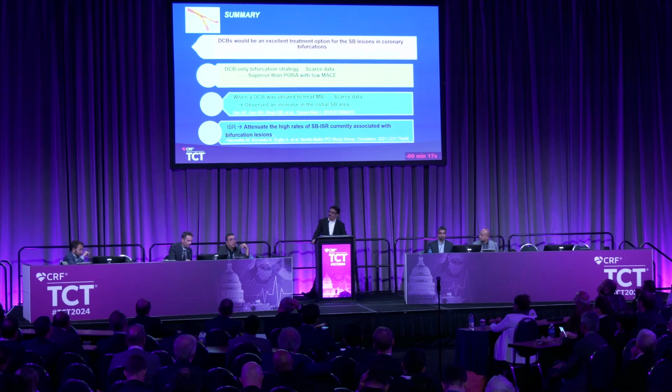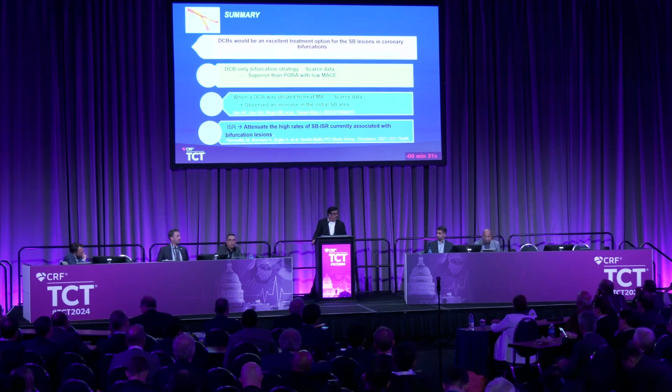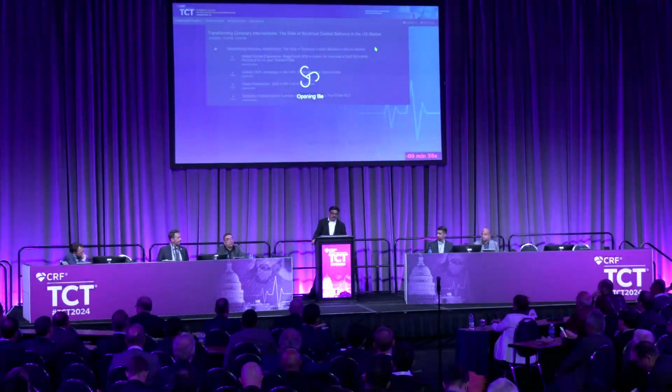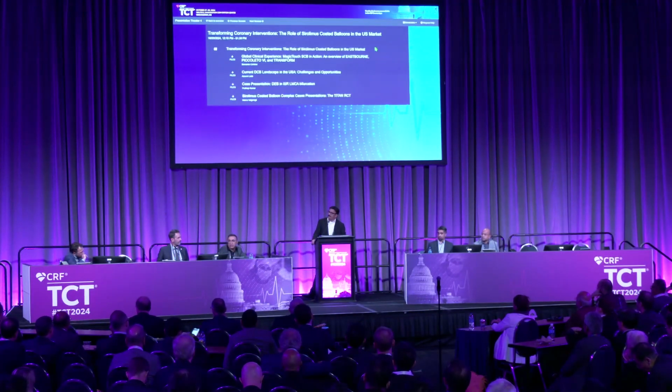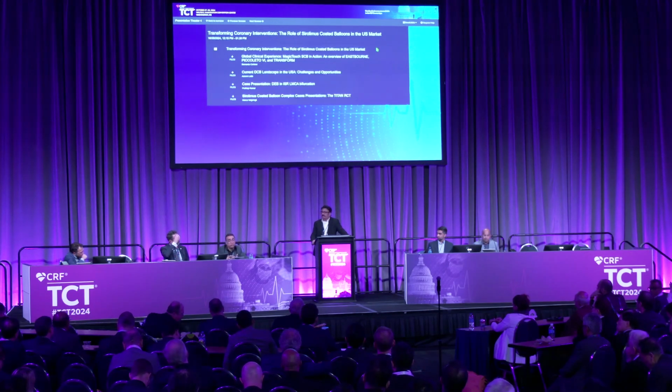Yeah. So maybe I'll just use Ajay's words because he should say this. When we look at the AGENT study, I think, what is it, 68, 70% of patients had intracoronary? 74, yeah. 74% had intracoronary imaging, right? And you saw those curves I showed in my presentation, how well they separate. I honestly believe a lot of that has got to do with using intracoronary imaging in order to be able to get better lesion preparation.